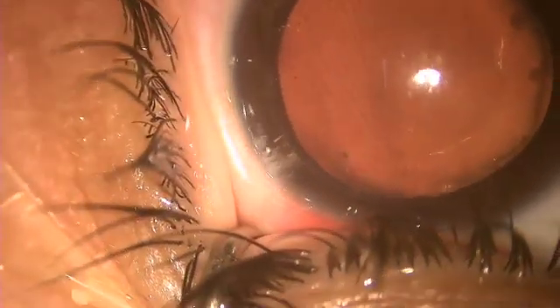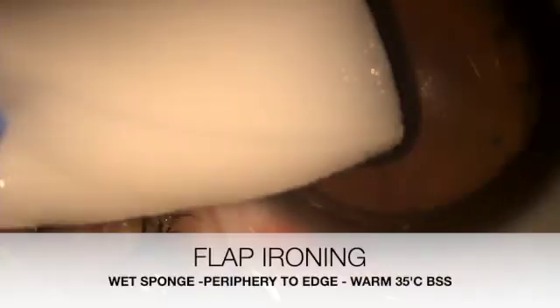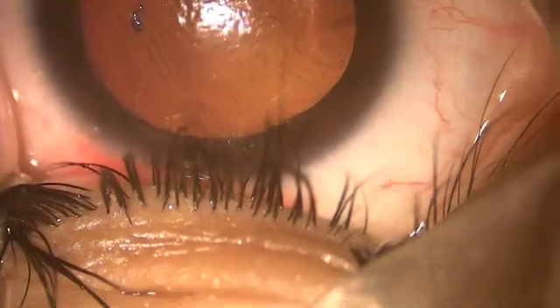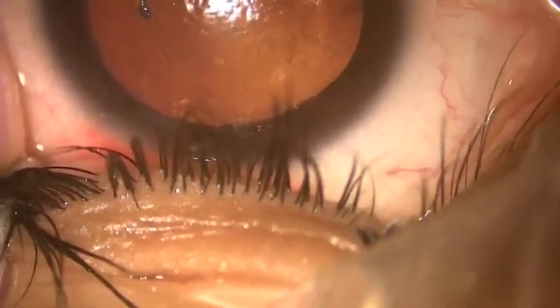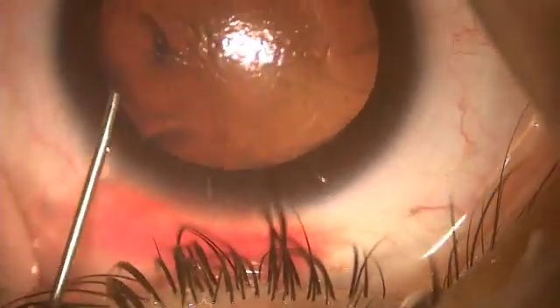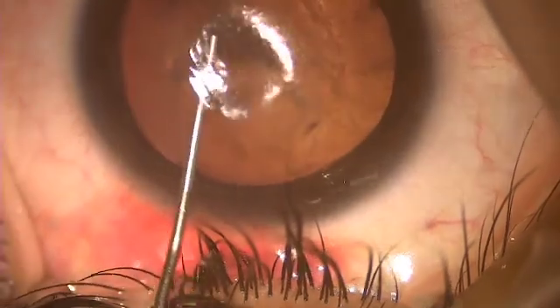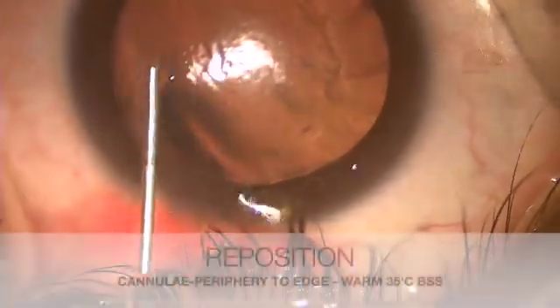Again ironing it out. The care here is the wet sponge should be, and it has to be perpendicular to your fold areas. Usually these microstriae are caused because of a trauma or excessive rubbing, and early identification is very important. This is the third go which we are doing. Do it very gently.